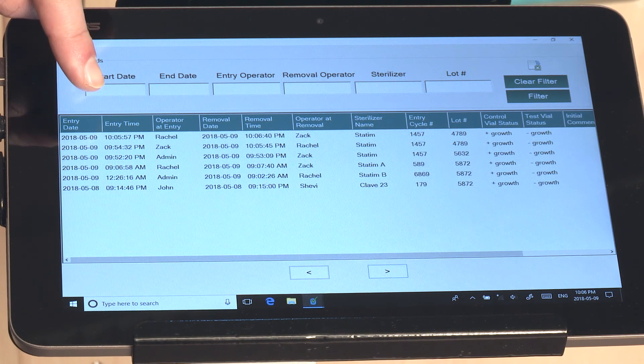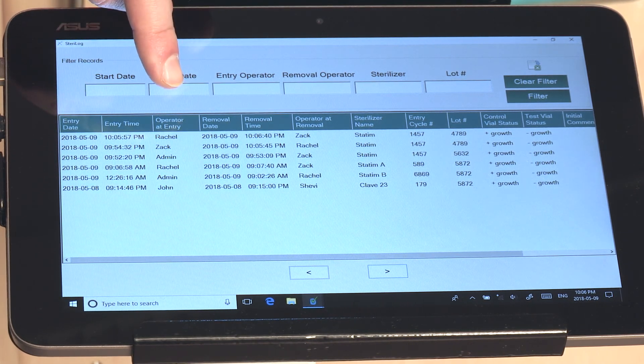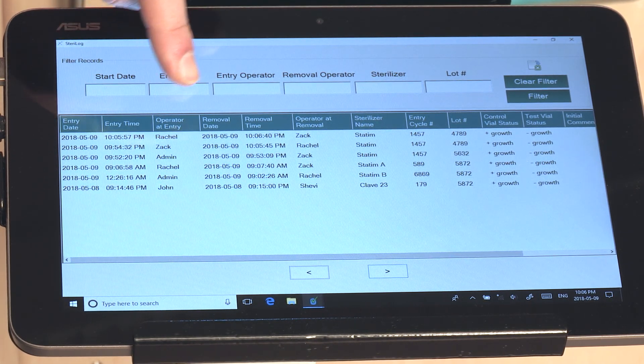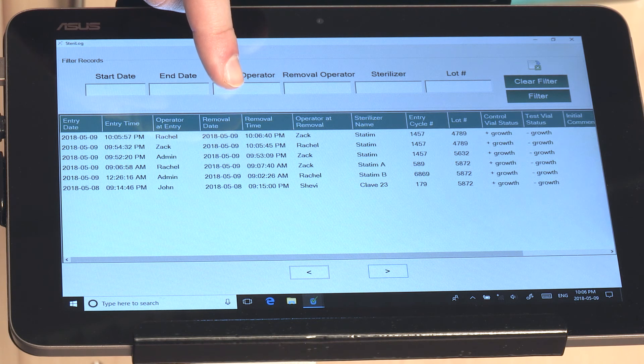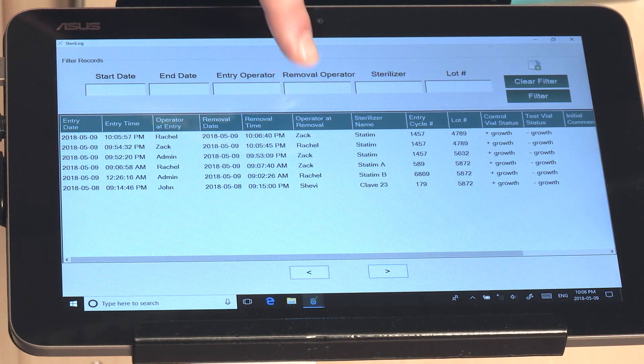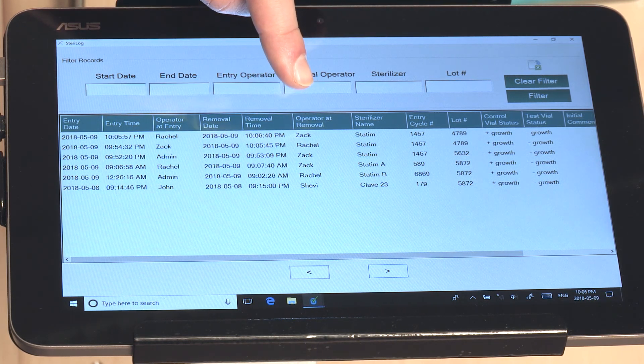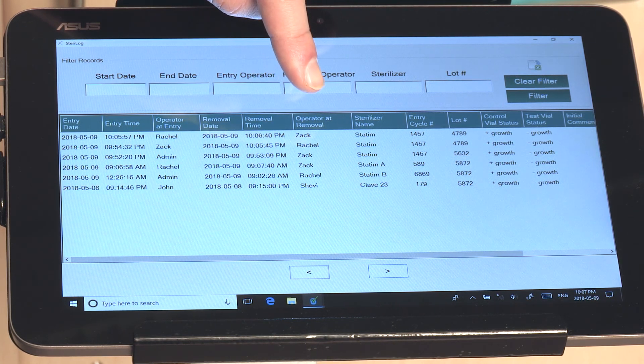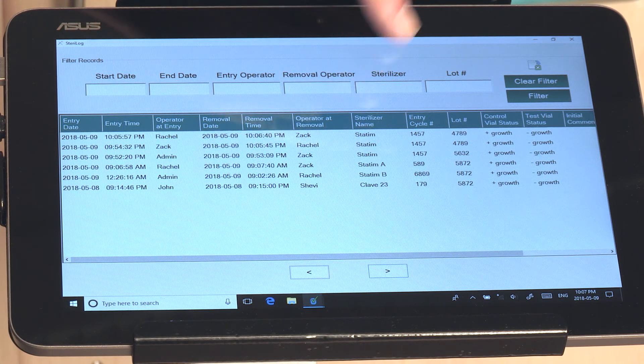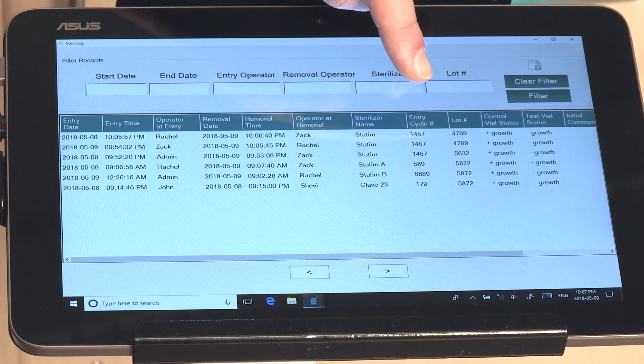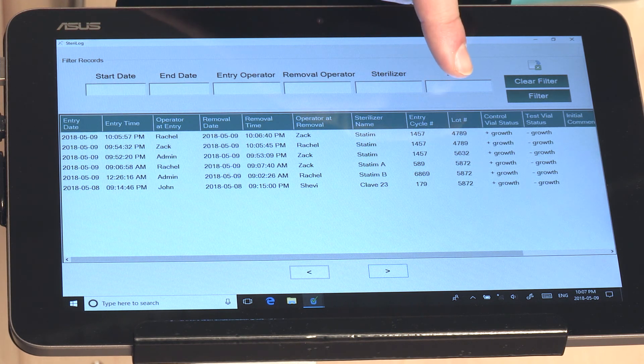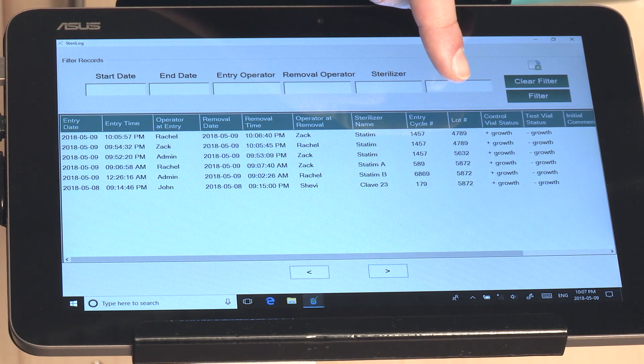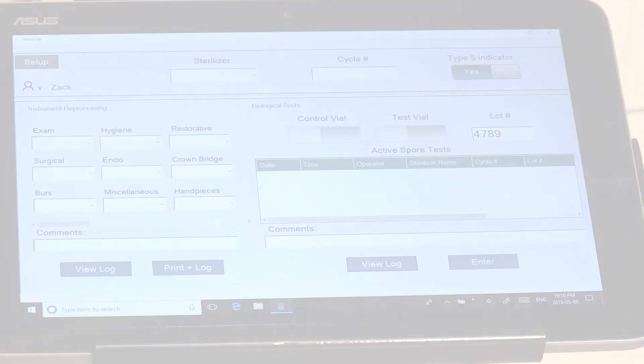So you can see the timestamp of entry, the operator that entered the spore test, the timestamp of removal as well as the operator that certified and removed the biological indicators, the sterilizer cycle number that it was entered in, the lot number, as well as the test results.